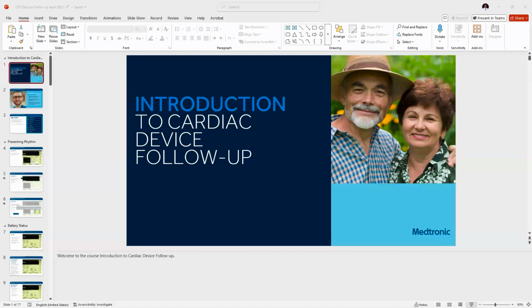And this might end up affecting your sensing and thresholds. In case there's a spike in the impedances, there's a possibility you're going to experience a similar spike in threshold and sensing also.